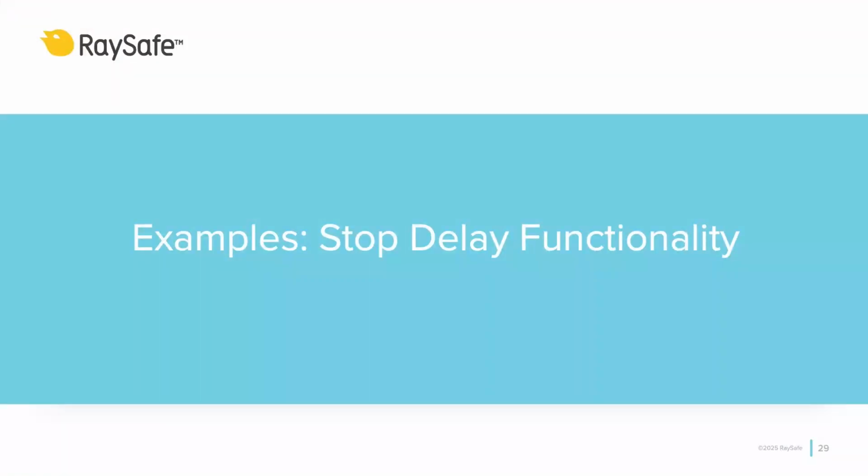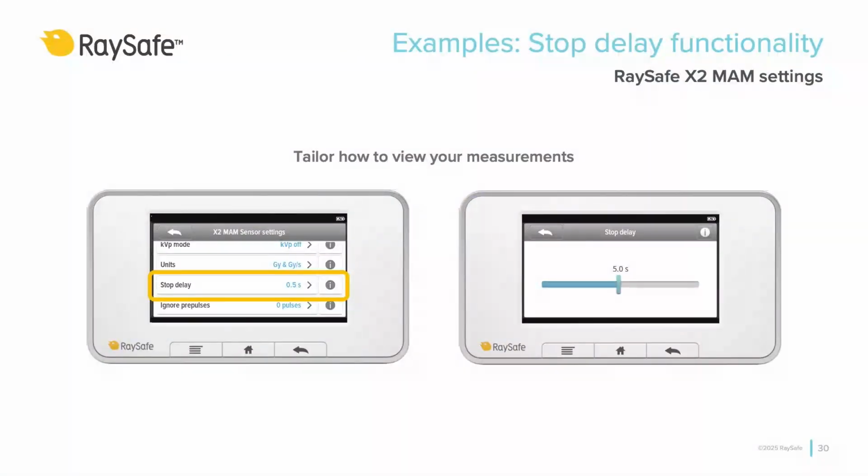A useful setting in the X2 system to know about is stop delay. It is a very handy tool if you are dealing with several exposures in the same screening. The setting is easily accessible from the settings in the base unit. What it does is that after an exposure, the system will wait a certain amount of time before the measurement ends. The system is still active during the stop delay, waiting for more radiation to be included in the same measurement. And why is this useful?